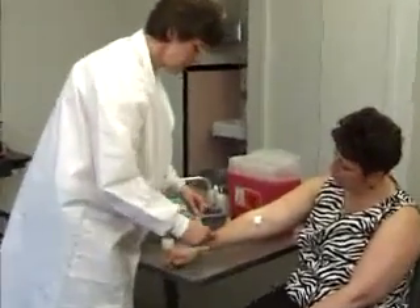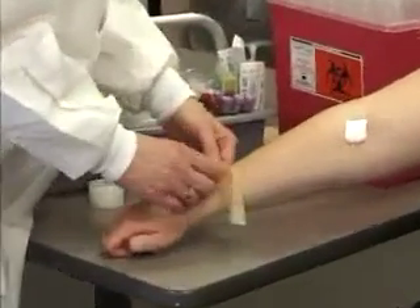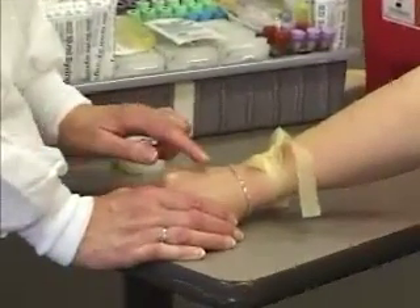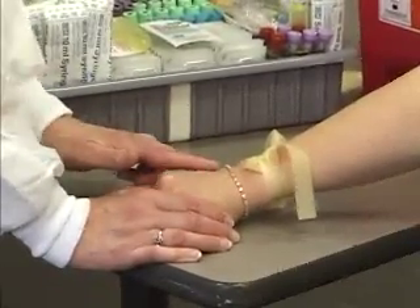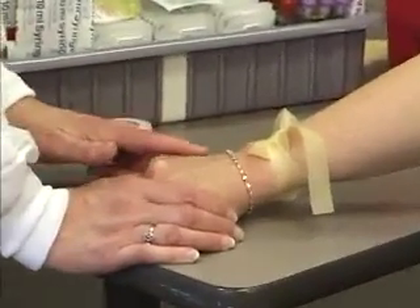You want to tie the tourniquet on around the wrist, again getting it kind of tight, and you want to palpate across the back of the patient's hand. This patient actually has about four veins that we could use for this procedure. You want to make sure that the vein is very straight, and make sure you know which direction the vein's going in.